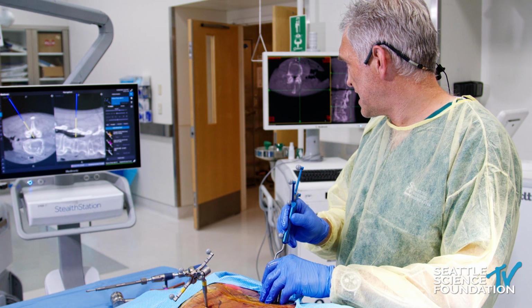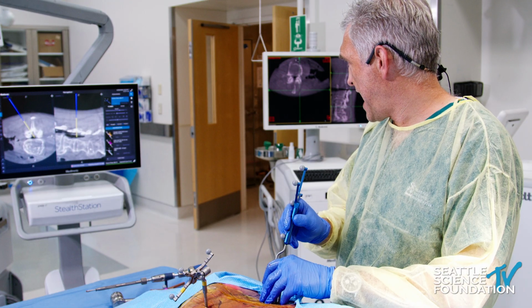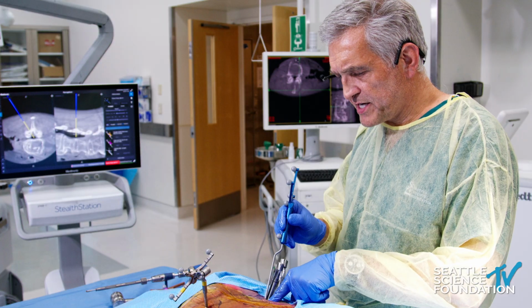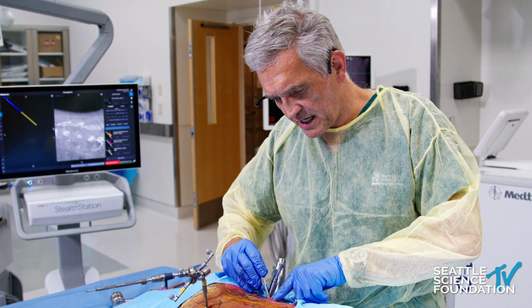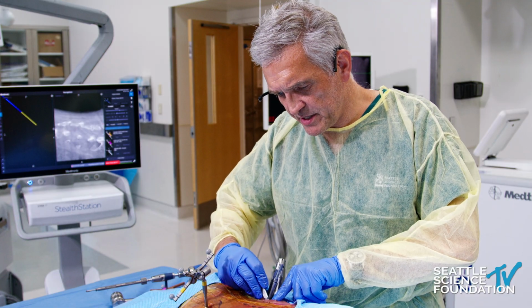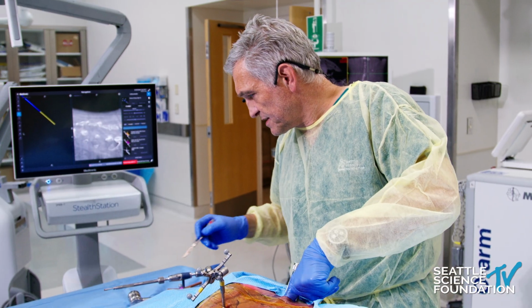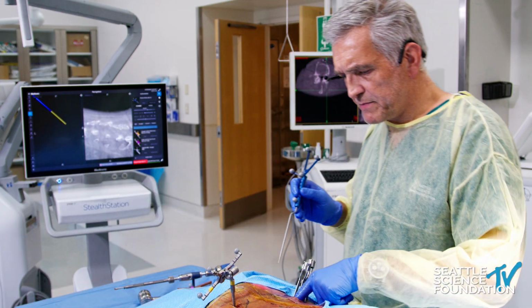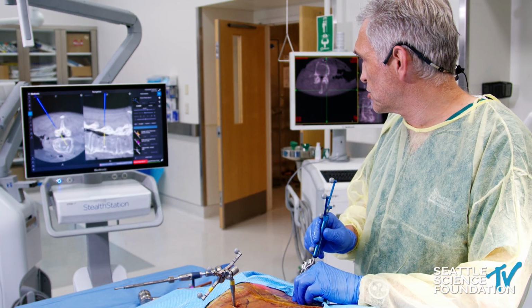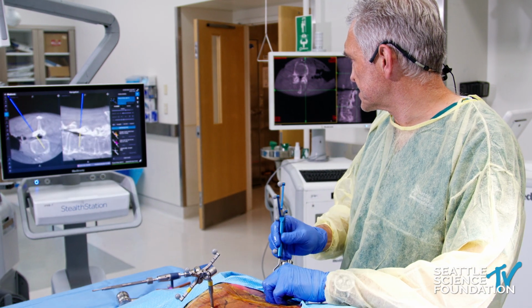So I'm aiming towards the inferior edge of the L3 lamina there, and this would be the location of the fascial incision that I would make for the tubular retractor. That would be about 1 centimeter more medial maybe. So that's the second fascial incision. Do you always do a second fascial incision, Roger? Well, for the T-lift part, yeah, I make a more medial incision, and now I go with the pointer, and now this is where I would dock. This is where I would put the dilators here.